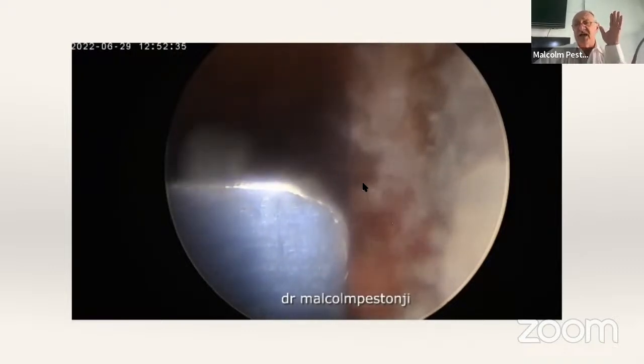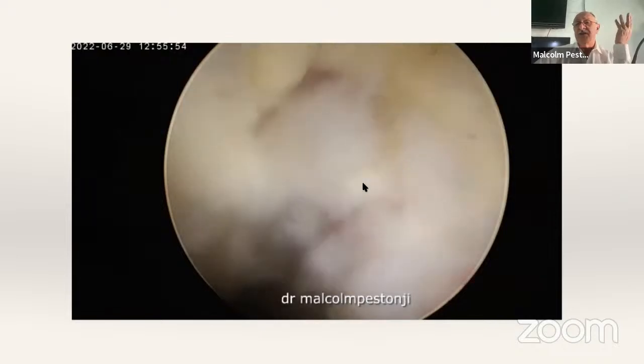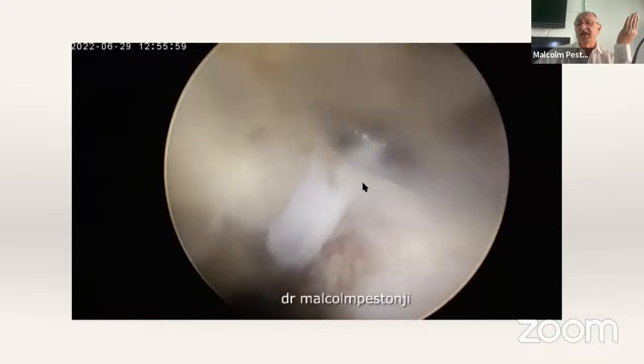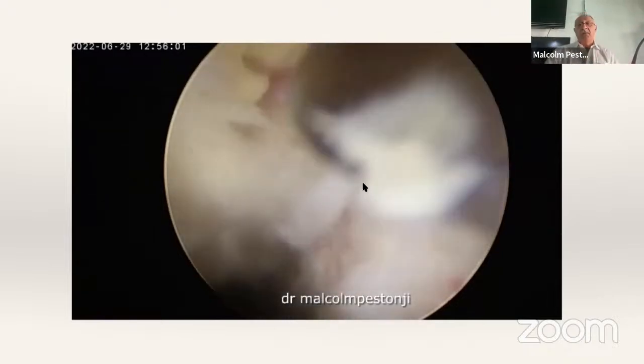After I put in the cage, I go ahead and do the flavotomy. The flavotomy is the last 5 minutes of the procedure, because by and large, once you put in the cage, the flavum separates on its own. The zone of separation is very easy, and you can do the flavotomy within minutes. But keeping the dura in, keeping the flavum in place means I can be a one-handed jack. I can put in my cage with one hand very peacefully with the scope in the other.